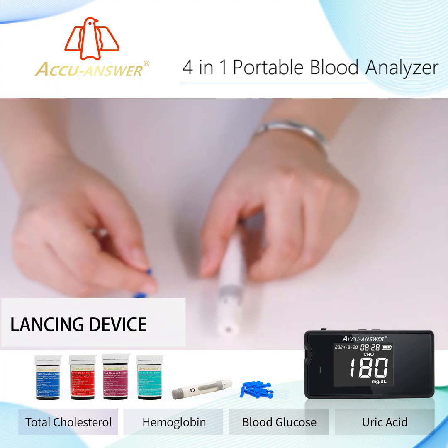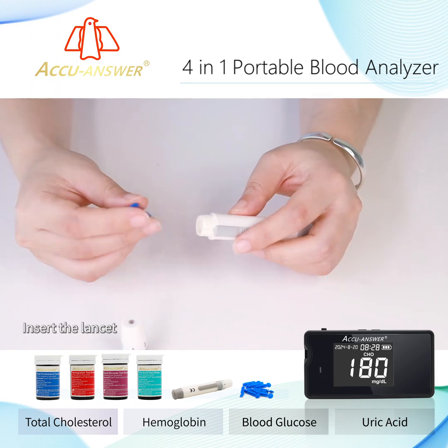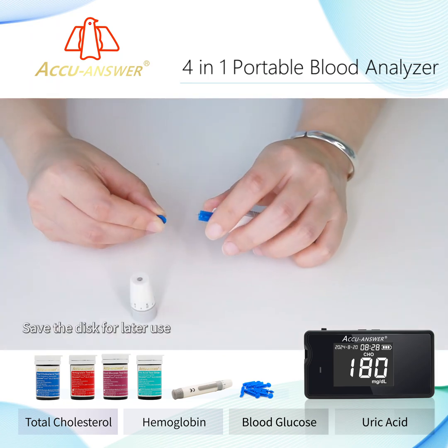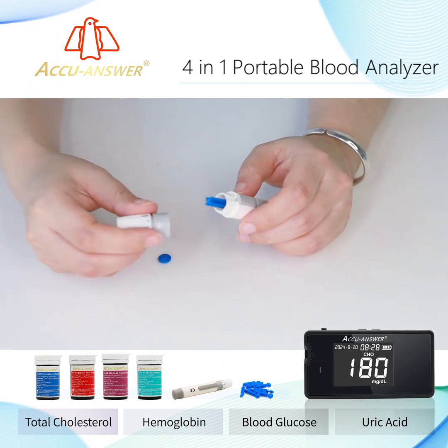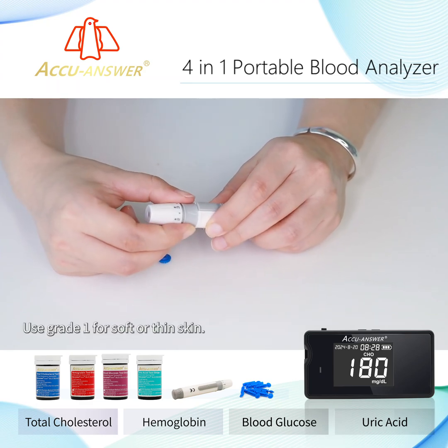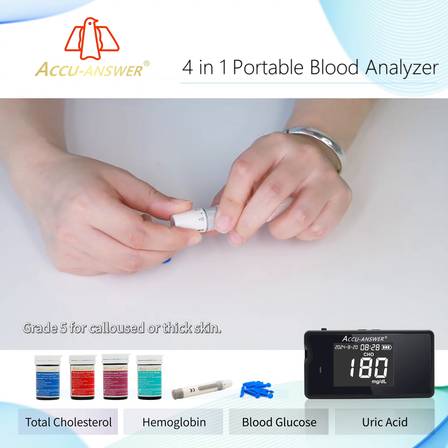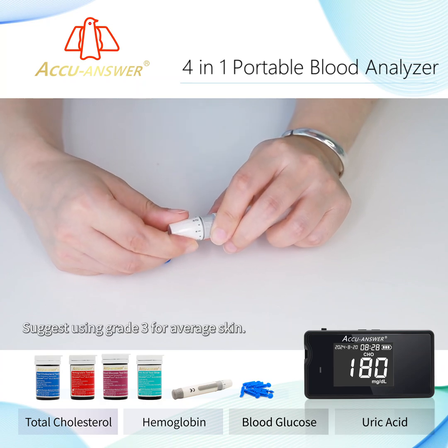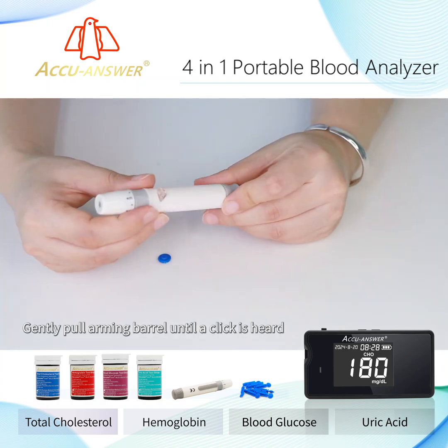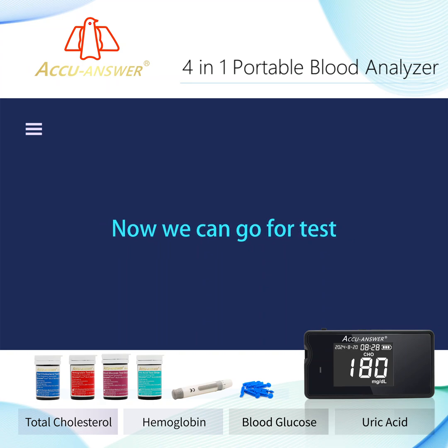Lancing Device Setup: Twist and remove the cap. Insert the lancet, then twist the protective disc and save it for later use. Replace the cap. Adjust the puncture depth — use Grade 1 for soft or thin skin, Grade 5 for calloused or thick skin, and Grade 3 for average skin. Gently pull the arming barrel until a click is heard. Now we can go for the test.